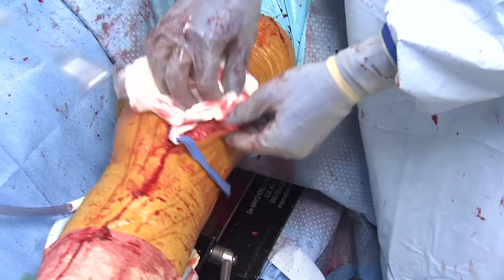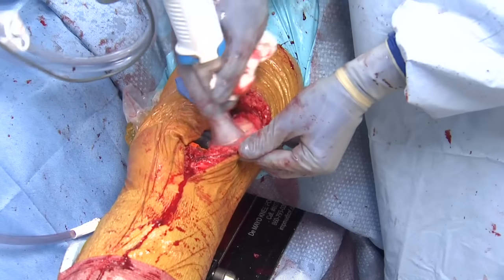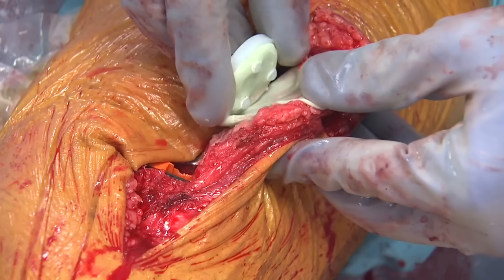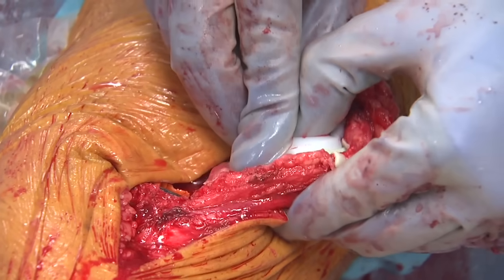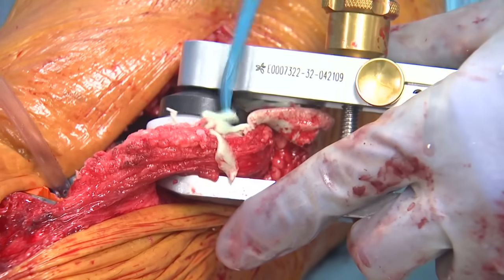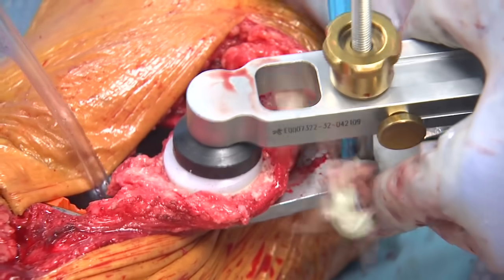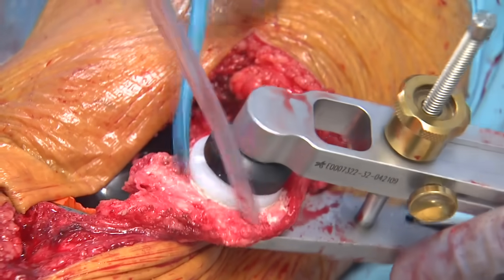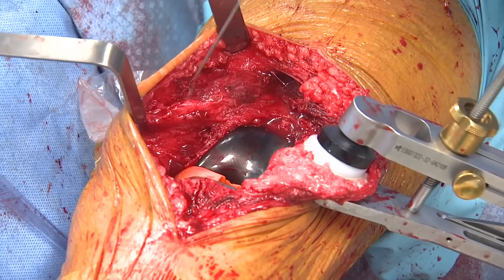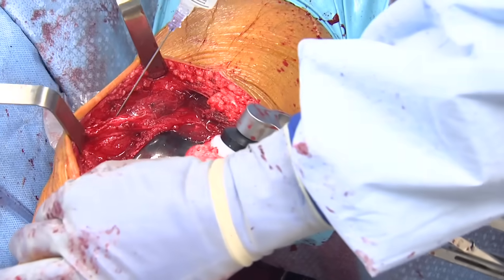Attention is then turned to the patella, which is washed and prepared for cementation. The patellar poly is applied and excess cement is removed appropriately. Peripatellar, periosteal, and local soft tissues are infused with local anesthetic at this time.